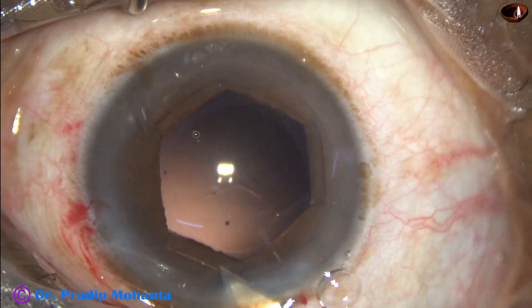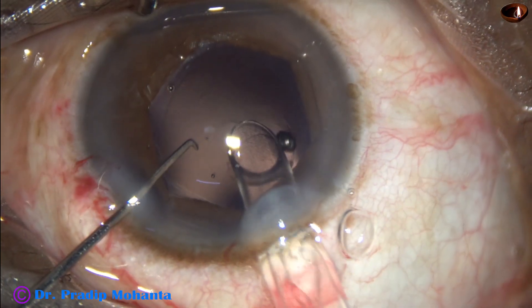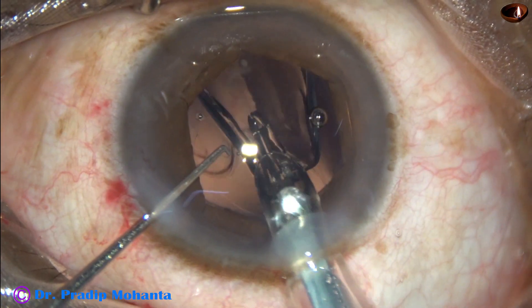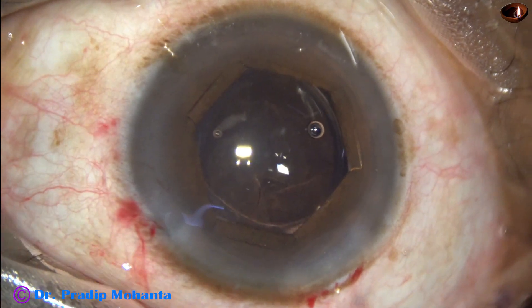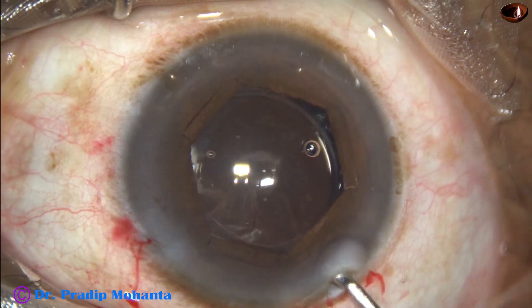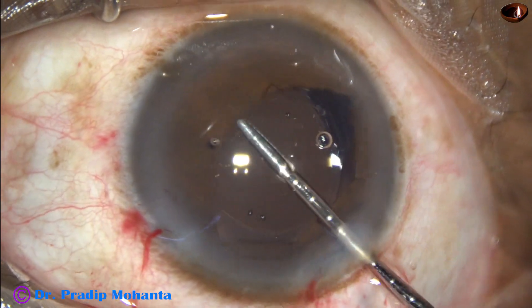The main wound is enlarged slightly to obtain a wound of about 3 millimeters, and then a hydrophilic acrylic single-piece monofocal aspheric intraocular lens is implanted in the capsular bag. The lens is dialed to orient the haptics at 3 o'clock and 9 o'clock so that I can easily go behind the nucleus.